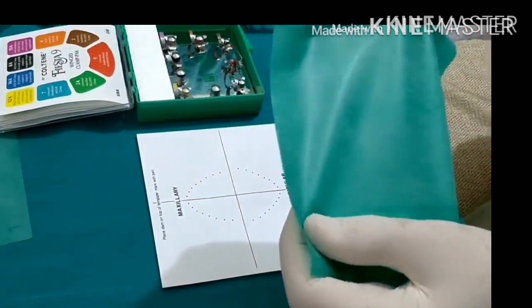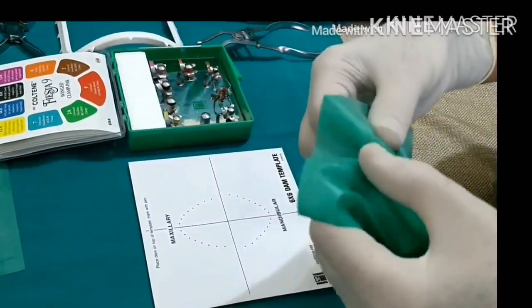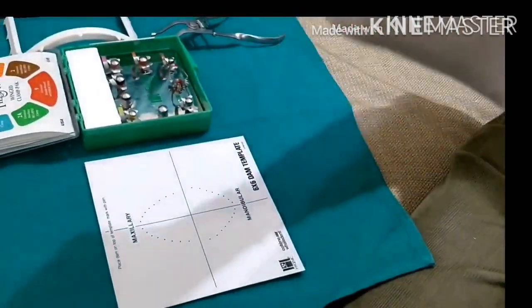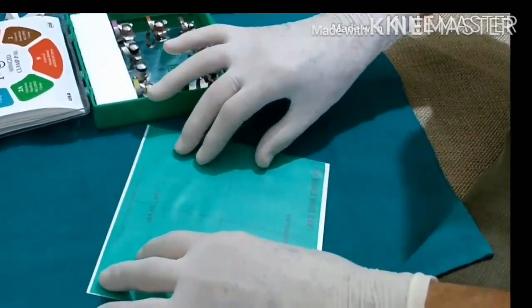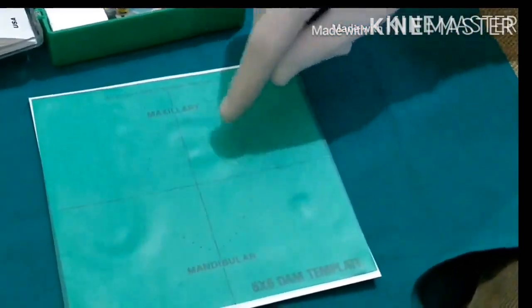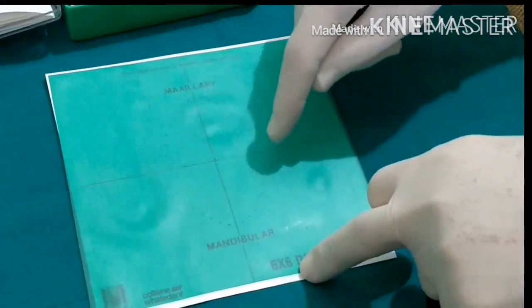The rubber dam sheet is six inches by six inches and comes in thin, medium, and strong thickness. It is spread onto the template and you can see the marks from the central incisor onwards to the eighth tooth for maxillary teeth, and similarly from the central to the eighth for mandibular teeth. Whichever tooth you want to expose, you just mark it on the template.